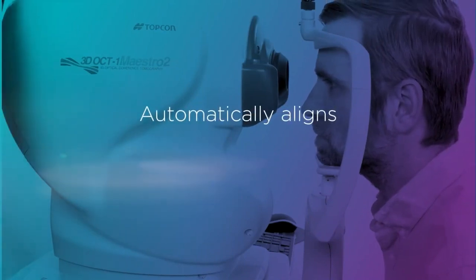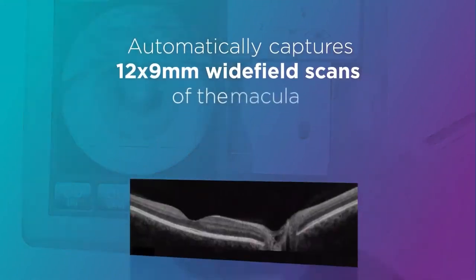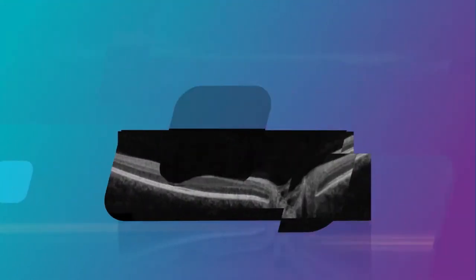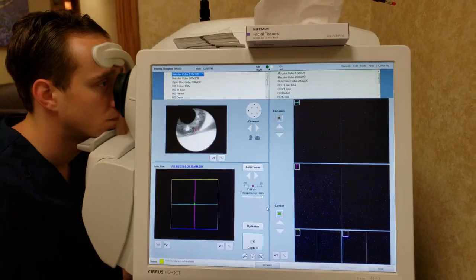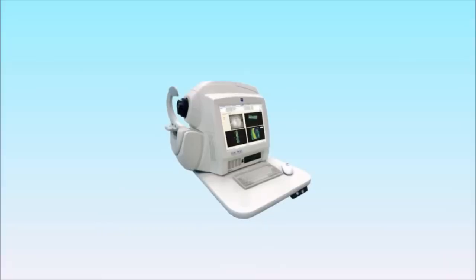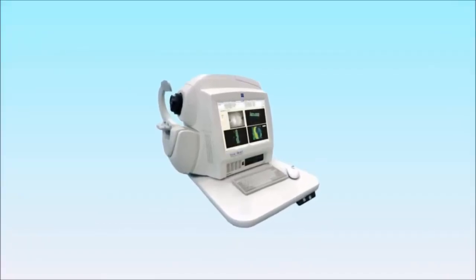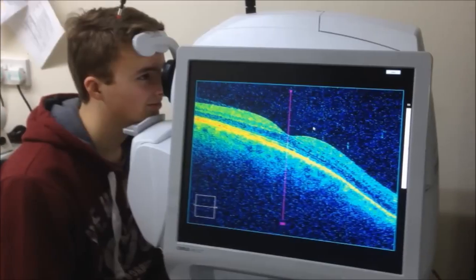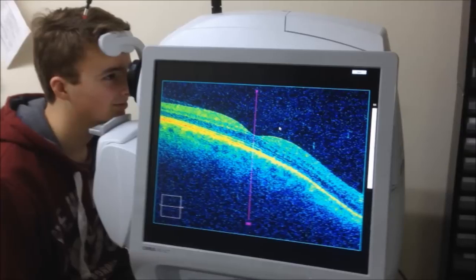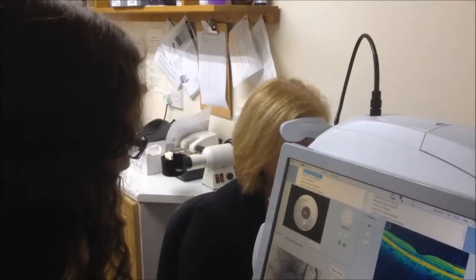OCT provides serial scans which are helpful in quantifying the amount of intra-retinal or sub-retinal fluid. The second category is sub-retinal fluid collections, specifically serous retinal detachment. The classic example is central serous chorioretinopathy, or CSCR. Serous fluid, with or without sub-retinal precipitates, causes elevation of the sensory retina. Biomicroscopically, it resembles a transparent bubble. Fluorescein angiography shows slow filling of the dye, while OCT reveals an optically empty space with or without cells or exudates.